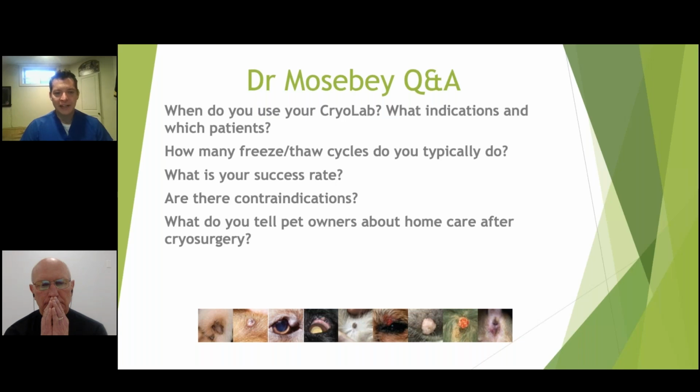And then at 4 or 5 days, we like to start seeing some response, that you're getting some of the tissue necrosis, you're getting some black, scabby tissue. And usually I feel like it takes about 2 weeks to see if you're getting full resolution of the lesion.